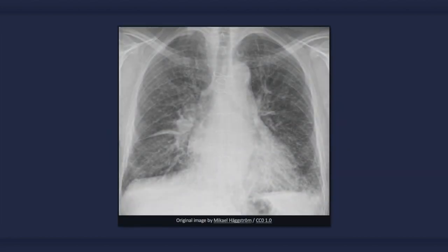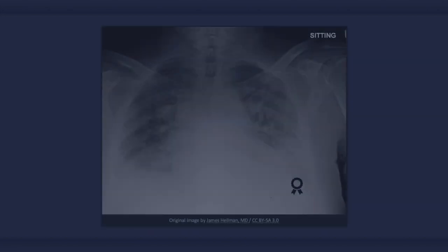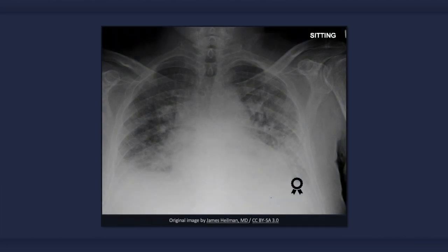Alveolar edema is a more severe sign of congestive heart failure and is not clearly evident in the radiograph we have thus far been examining. In this image, many of the aforementioned findings of congestive heart failure are present, plus alveolar edema, which classically results in central and symmetrical airspace disease. The outer third of the lung is frequently spared, resulting in a characteristic batwing configuration.